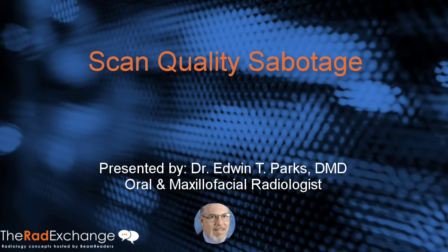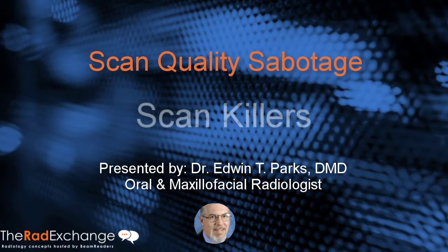Today we're going to talk a little bit about things that sabotage your image quality. We like to call those scan killers.